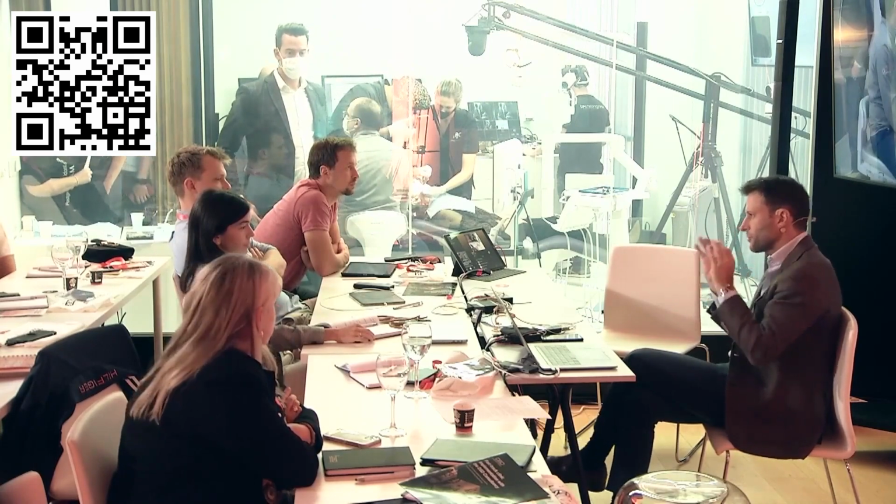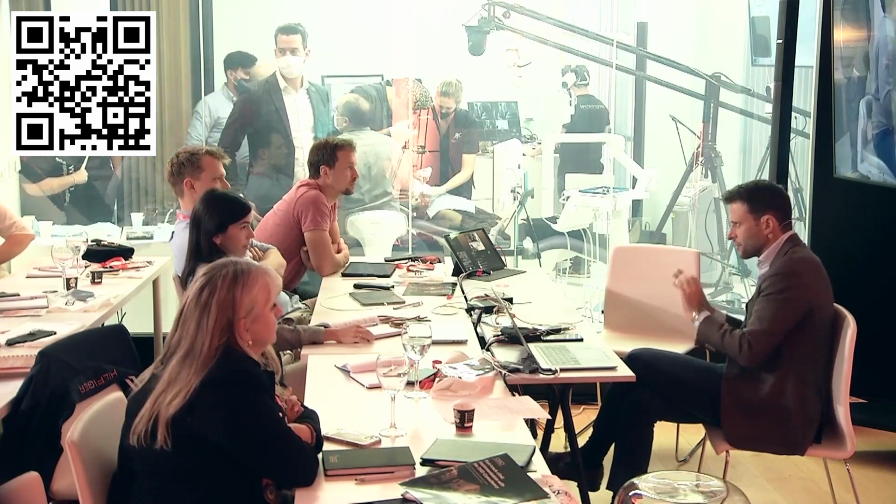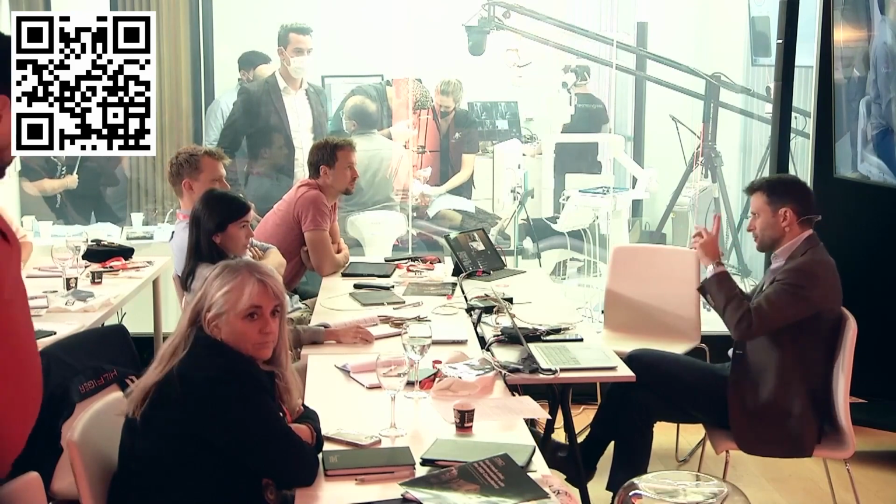Since we didn't try in the immediate loading, and it was completely digitally designed, even though we have the face on the computer, it's always a little bit different when you put it in the mouth. So when you deliver the immediate loading, the patient is healed and back to normal, you usually may see things that you want to improve. That's when you should redo the pictures, so you start making the changes at that moment.